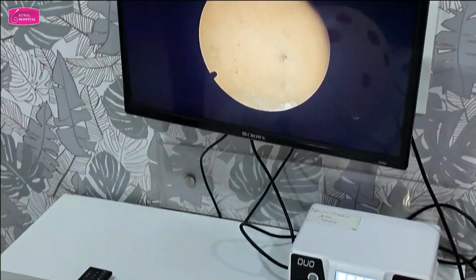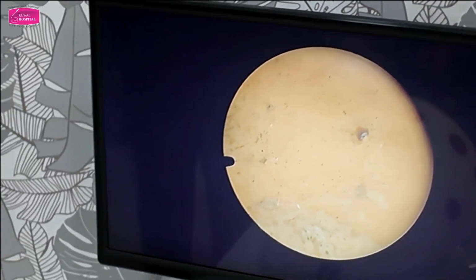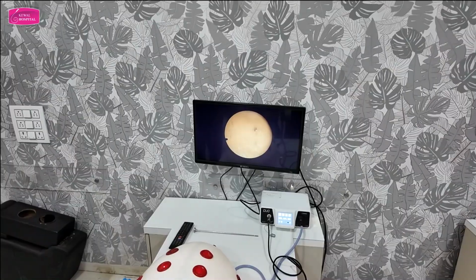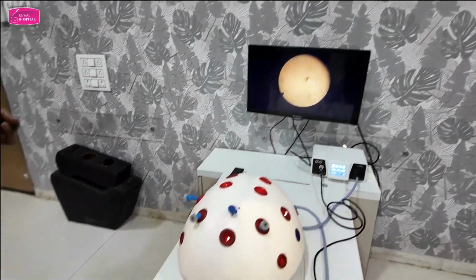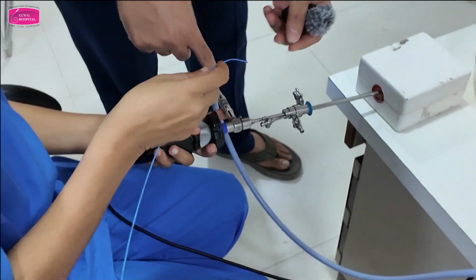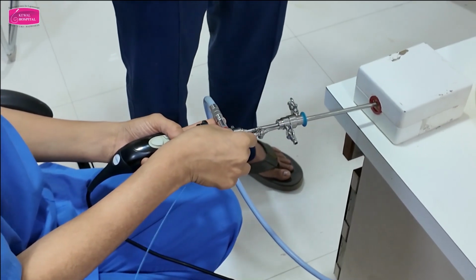Now do the cannulation. How to hold? Now if you hold it like this, how do you do the cannulation? No. This hand hold here. Hold. Straighten the finger. Correct? Yes. Now your one hand is free. Now with one hand hold close to the ostia. You understood this?